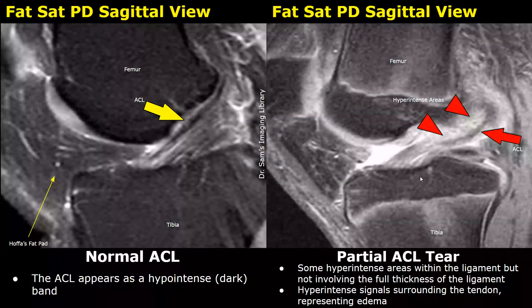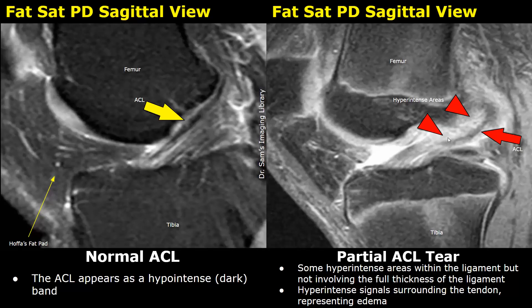This is another case of a partial ACL tear. In the normal fat-saturated proton density image, we can see a normal ACL. Whereas in this image, there are many hyperintense areas indicating hemorrhage and edema. We can still see some intact fibers of the ACL — there is only partial disruption of the fibers. So this is a partial ACL tear.